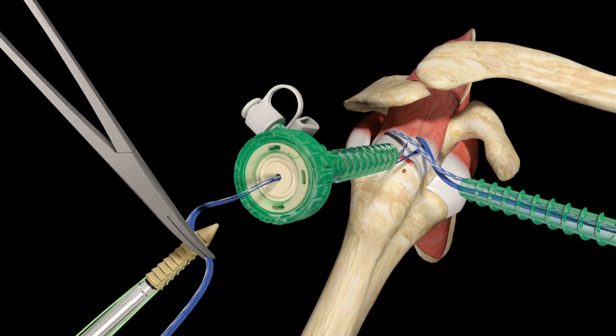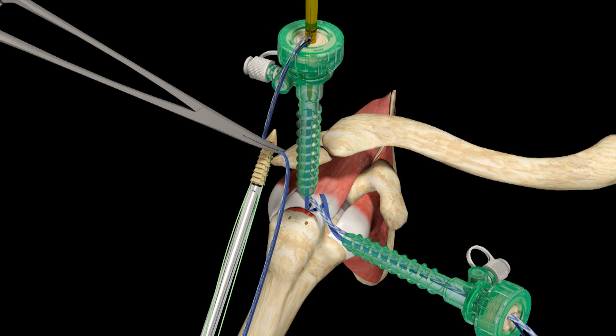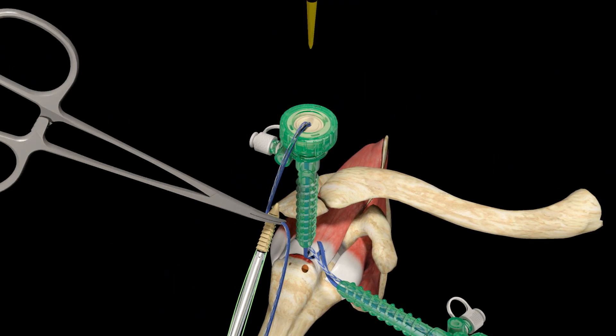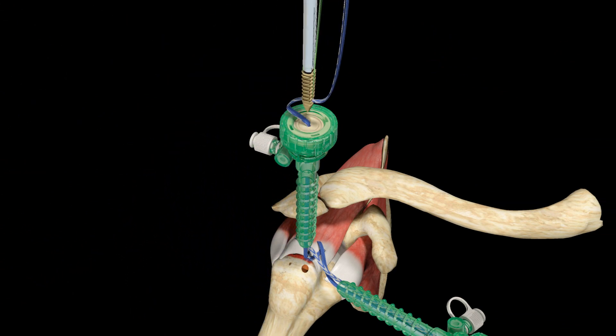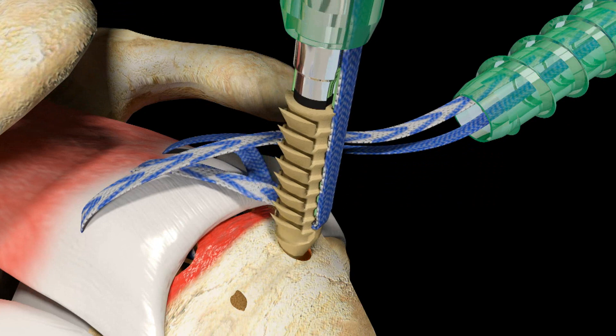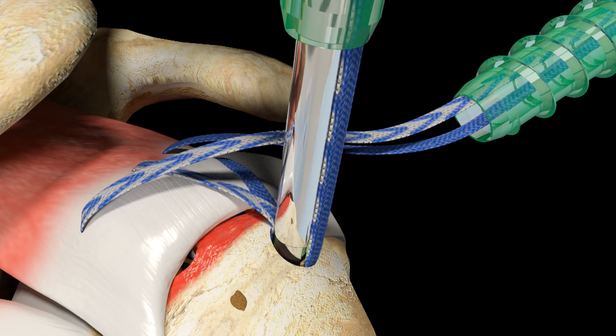Clamp a hemostat over the threaded limbs to hold them in place while a pilot hole is created. Introduce the gold tapered awl into the lateral cannula and create a pilot hole on the anterior lateral aspect of the greater tuberosity, using the radiofrequency marks to guide placement. Tap to ensure the black laser line on the awl is flush with the bone, then remove the awl and hemostat. Taking up a small amount of slack from the Ultra Tape limbs, introduce the Footprint Ultra PK suture anchor into the lateral cannula, taking care not to twist the sutures. Position the anchor over the prepared pilot hole, align the eyelet so it faces the tendon, and tap the anchor into the pilot hole until the black laser line is flush with the bone.